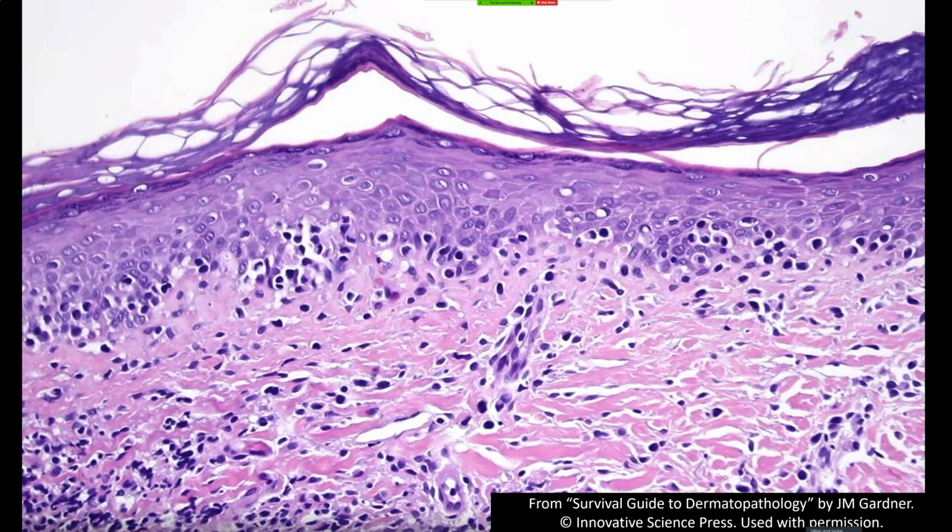Now, the problem is that other things like chronic spongiotic dermatitis will get fibrotic like this too. And in fact, when I put down a biopsy that looks like chronic spongiotic dermatitis and I see this fibrosis, right away I know the dermatologist probably has mycosis fungoides on their differential diagnosis, because the things that make it look chronic microscopically are going to make it look kind of like MF clinically too. So again, this is part of the problem, that it can be challenging both clinically and microscopically to sort this out with certainty.